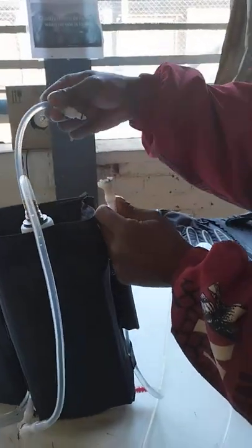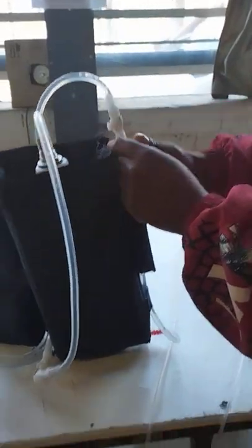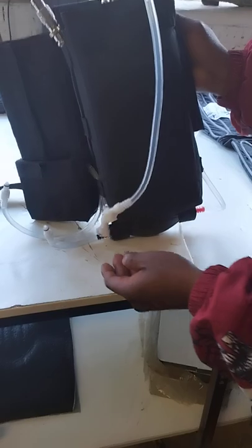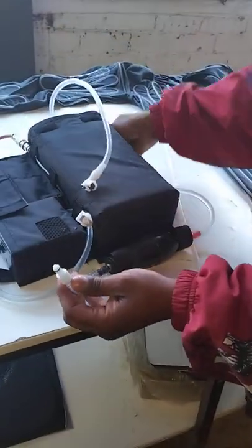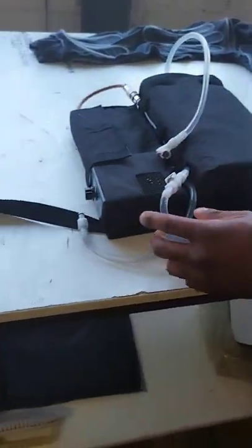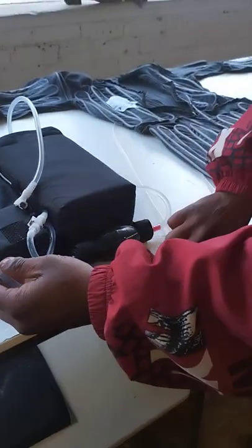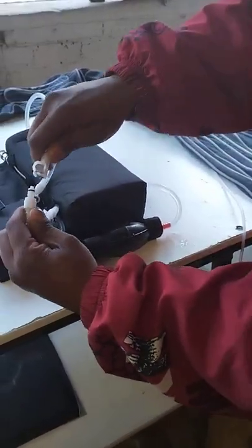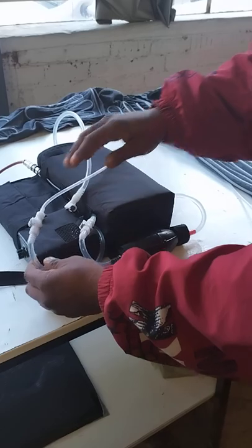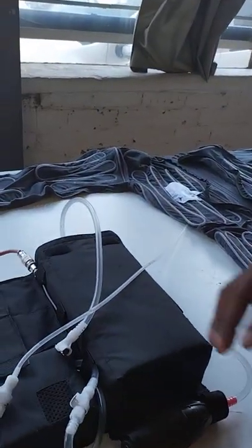Connect the out from the bottle to the in from the filter. Connect the out from the primer to the in on the pump. Connect the out from the pump to the in on the suit. Connect the out from the suit to the in on the bottle.